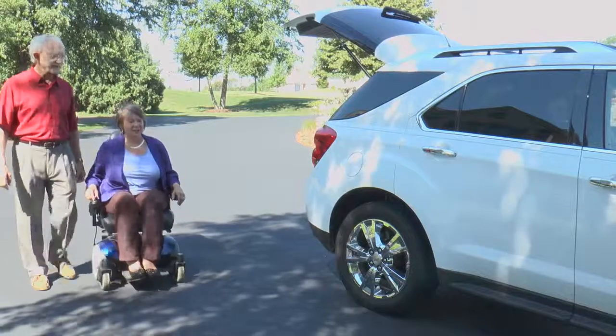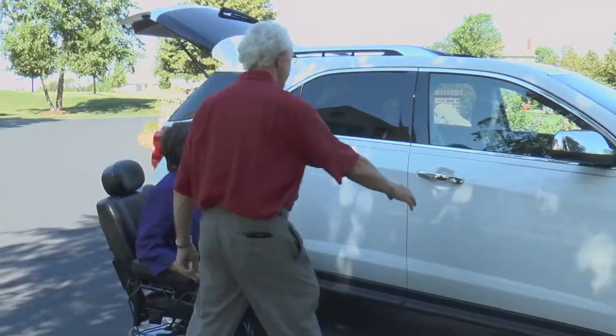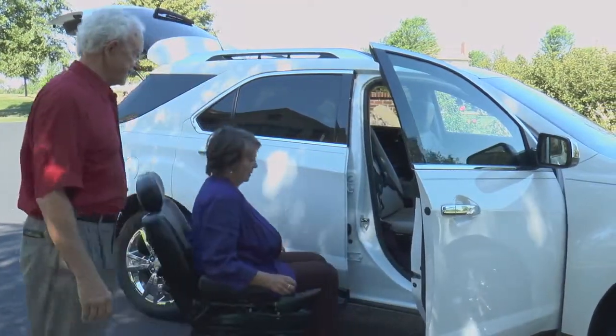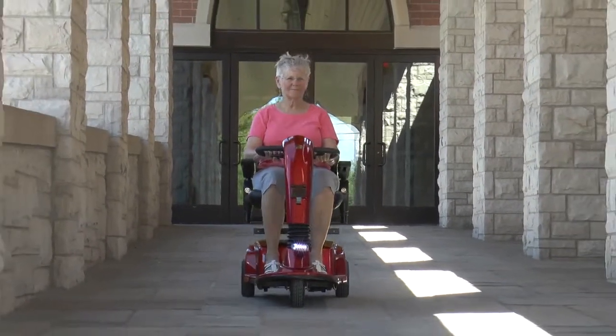If you change vehicles or mobility devices in the future, it's likely your Curbsider can be adjusted to fit your new vehicle and/or mobility device. It's this versatility and its ease of use that make the Curbsider a favorite.